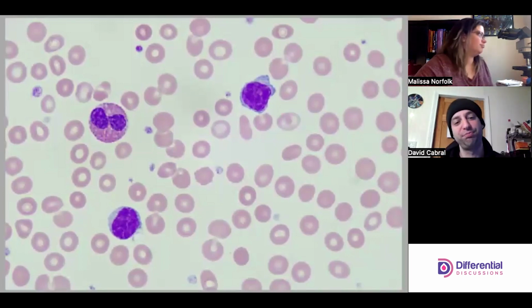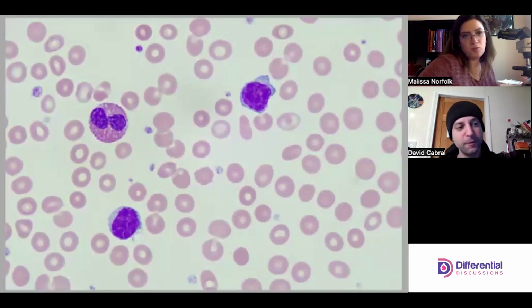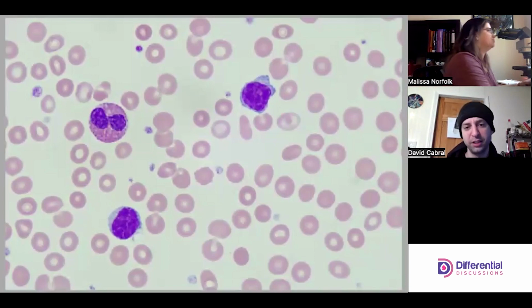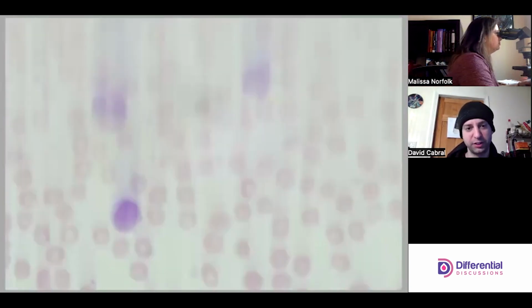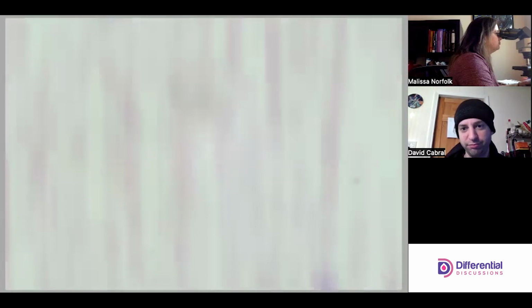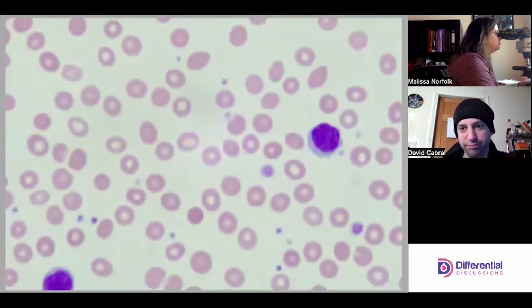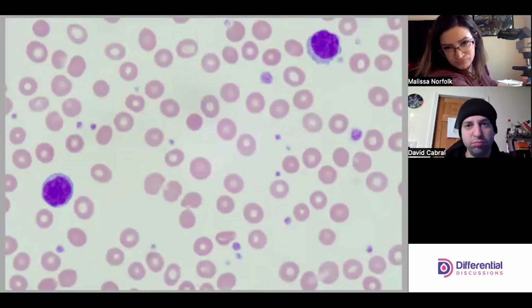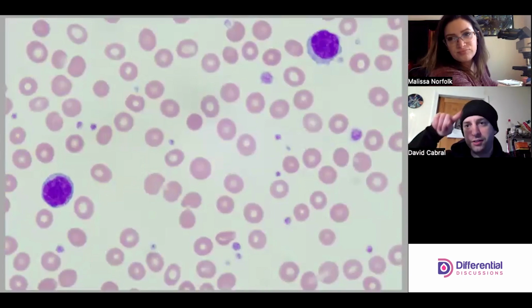All right, let's move once more and see if we find another hairy cell. Sure. Let's see what we got. What are the diff gods going to give us? So you've got little bumpies.